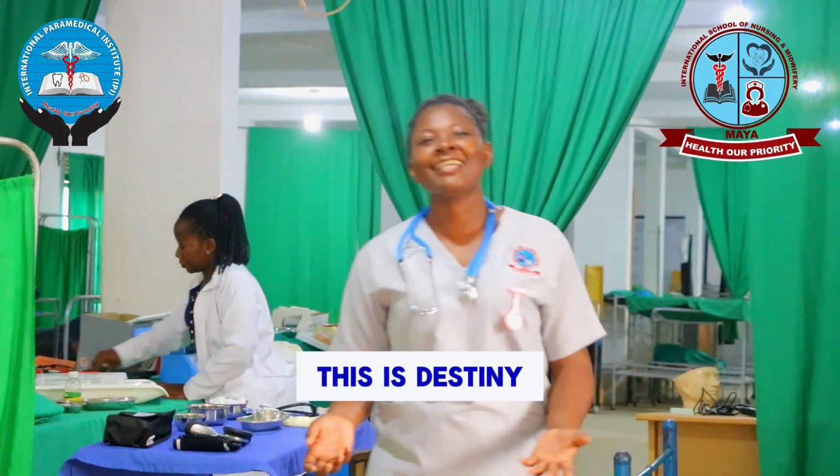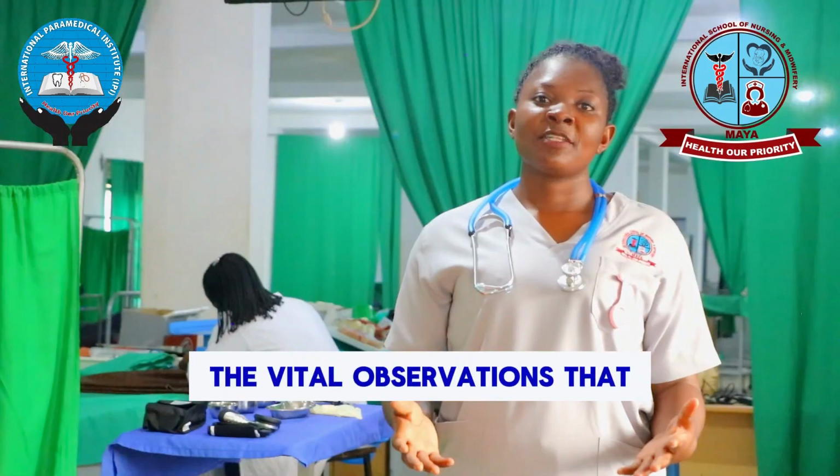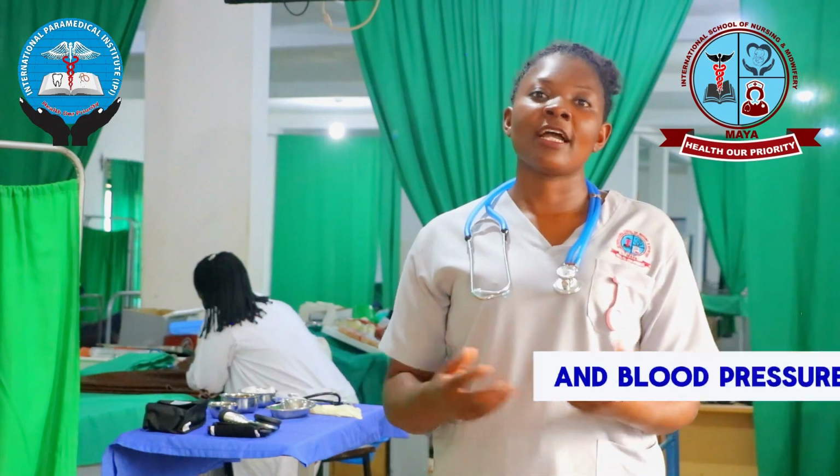Everyone, this is Destiny with another nursing video about vital observations. The vital observations that we are taking today are temperature, pulse, respiration and blood pressure.